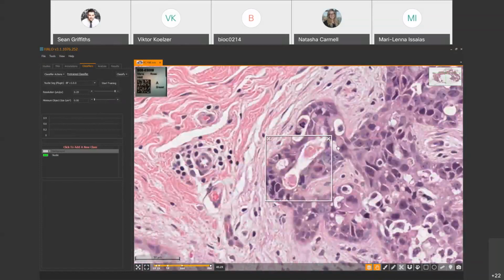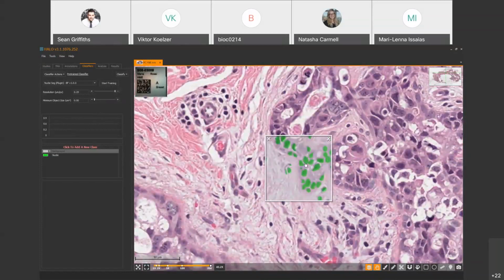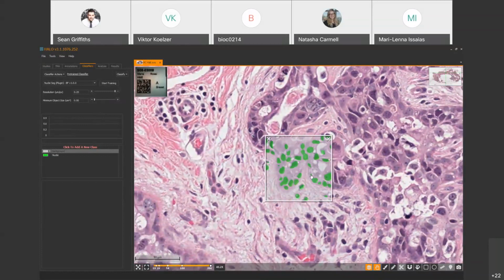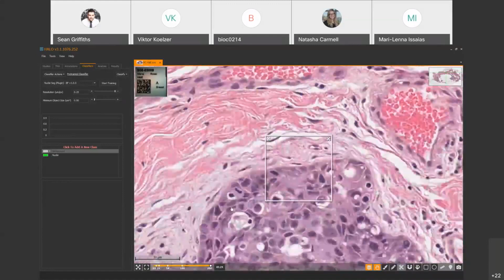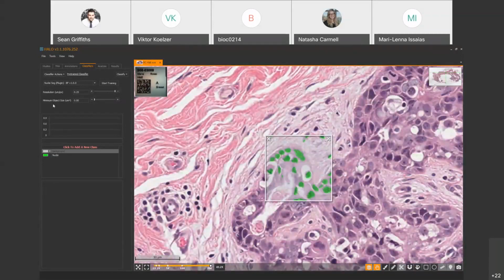This does a better job at finding them in difficult conditions. I mean, look in here. These would not be found using the traditional watershed segmentation. This is finding nuclei across difficult to analyze sections using a pre-trained set of training data. So we haven't had to mark out nuclei individually here.